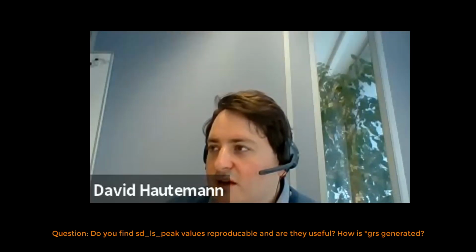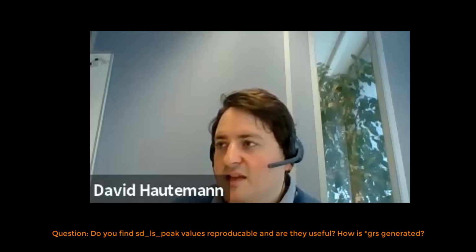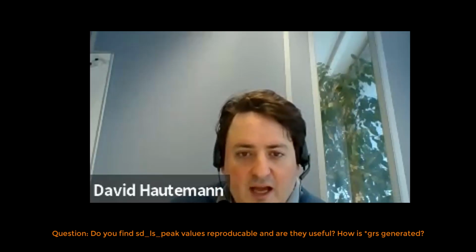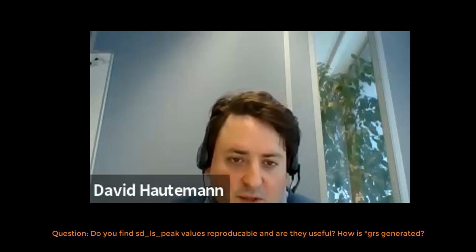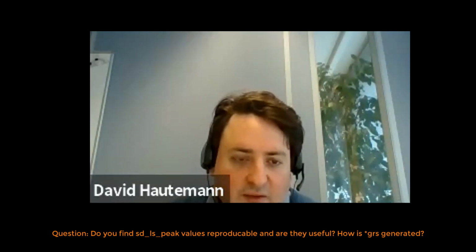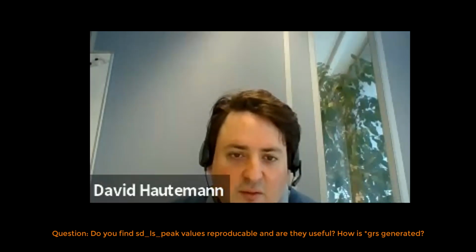Next question was whether the standard deviations of longitudinal strain peak values are reproducible and whether they're useful, and how the asterisk for the global radial strain is generated. Well, this was already answered a bit in the previous question. It's an index that could be used at the moment for research. At this moment, I don't know whether there's data on the reproducibility, but it could be taken into account when studying synchronicity or asynchrony of the heart.